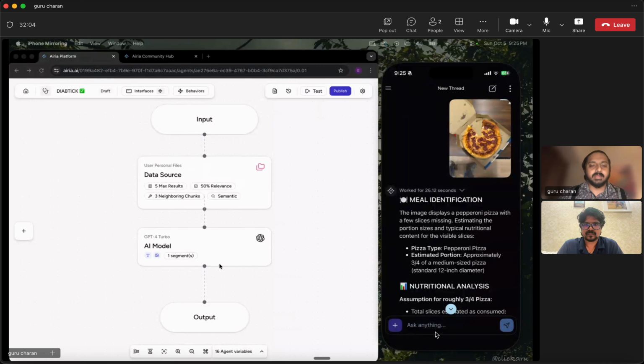That will take all this data along with the image to recognize the meal, and then give us the total nutritional components and the segregation in terms of how many carbs, sugar, fiber, and all the macro nutrients which would impact the insulin dosage. It will give a breakdown of how it is going to calculate the insulin dosage, as well as then provide the actual dosage recommendation.